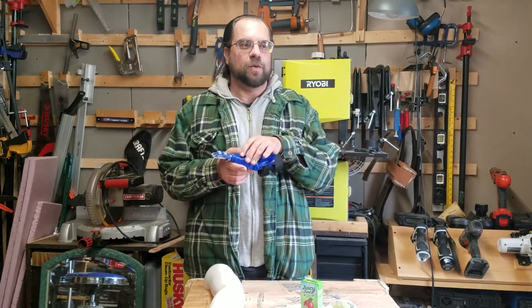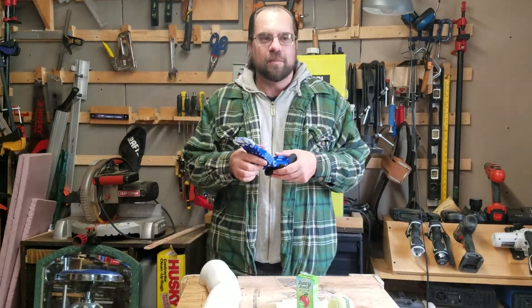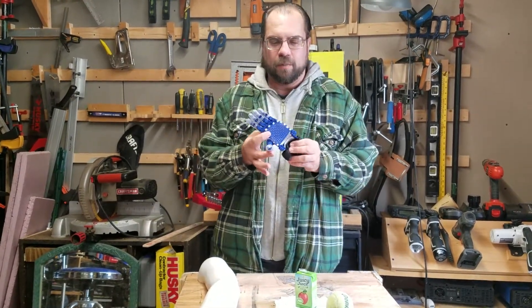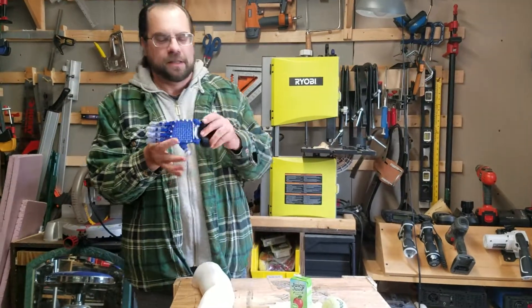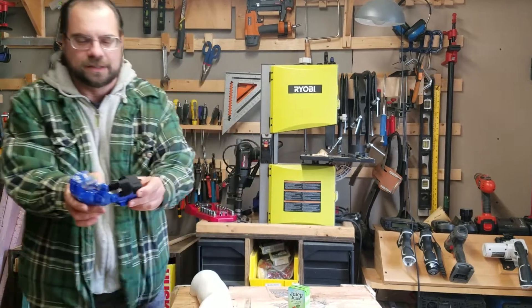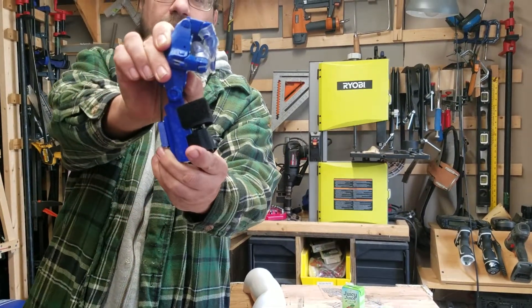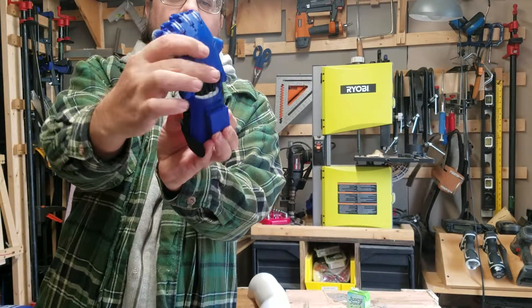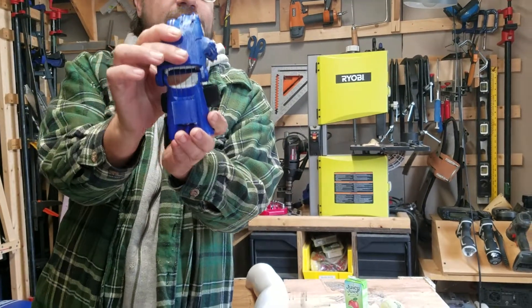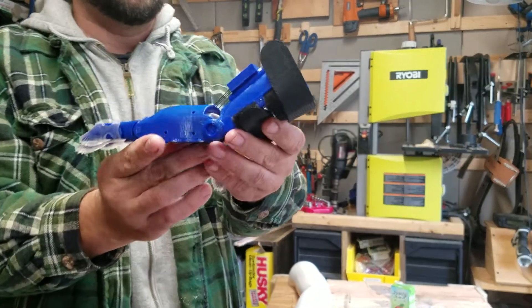I'll begin by manipulating the hand in multiple directions and bending at the wrist. As you can see, the fingers close, and the fingers touch the thumb. The strings are nice and tight, demonstrating this by turning the hand in different views.